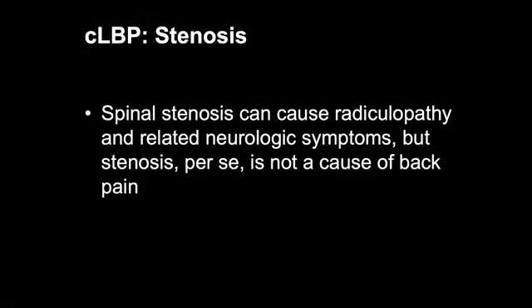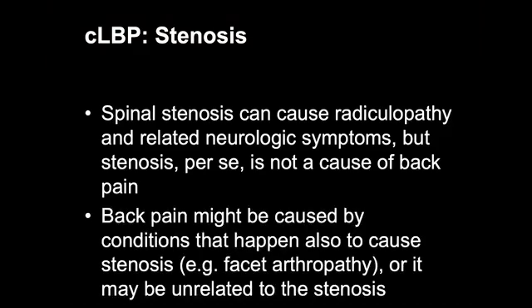Just a little bit about stenosis. So spinal stenosis can cause radiculopathy and related neurologic symptoms, but per se, it's not a cause of back pain. We can do a whole separate lecture on neurogenic claudication and venous hypertension and the things that occur related to spinal stenosis. However, back pain may be caused by conditions that also happen to cause stenosis, such as facet arthropathy.